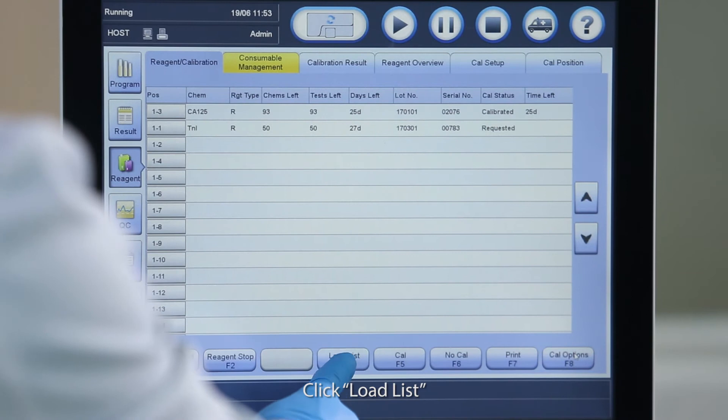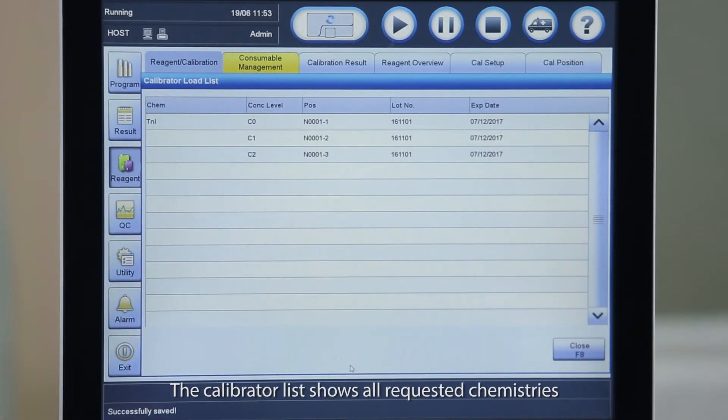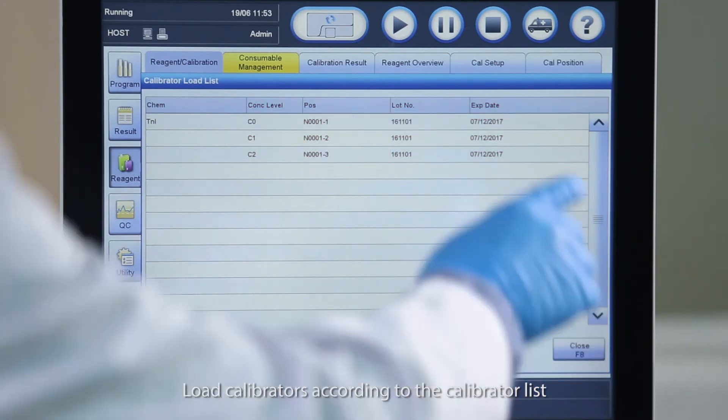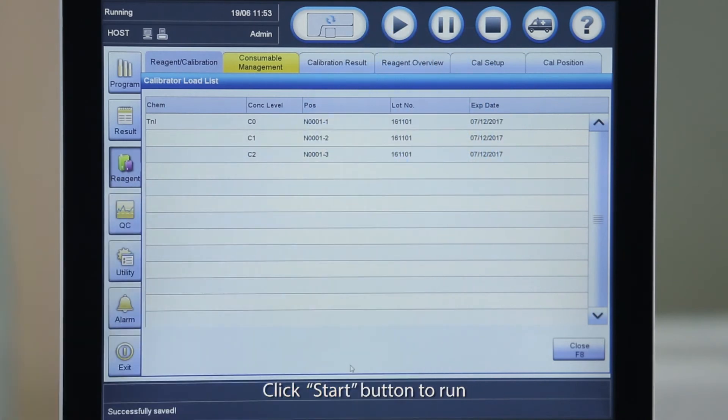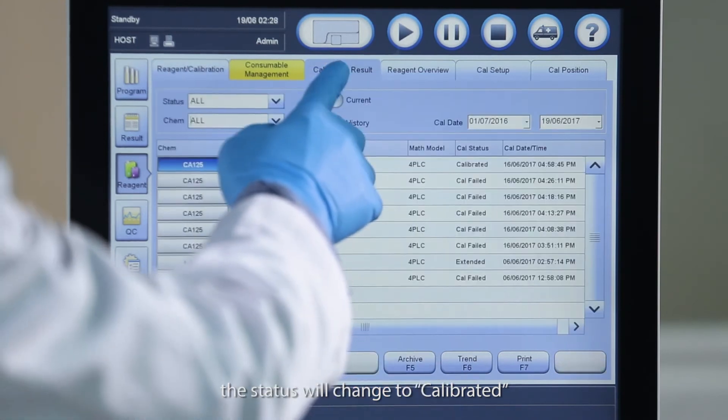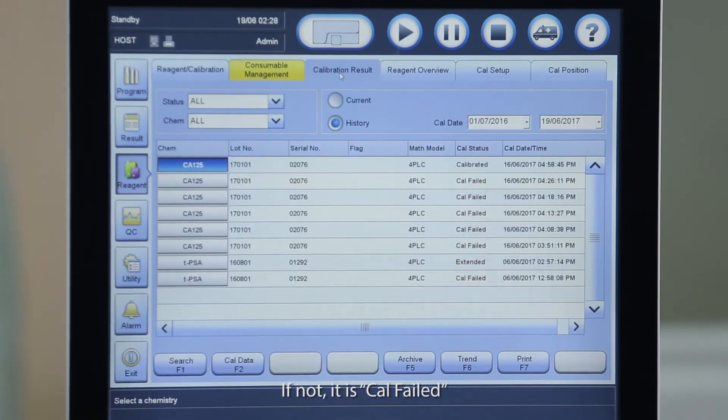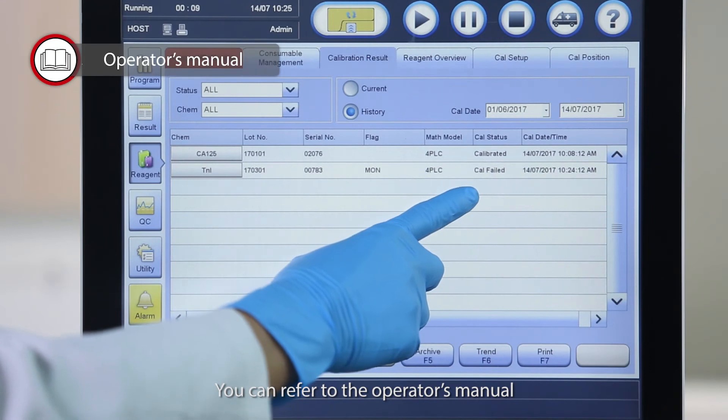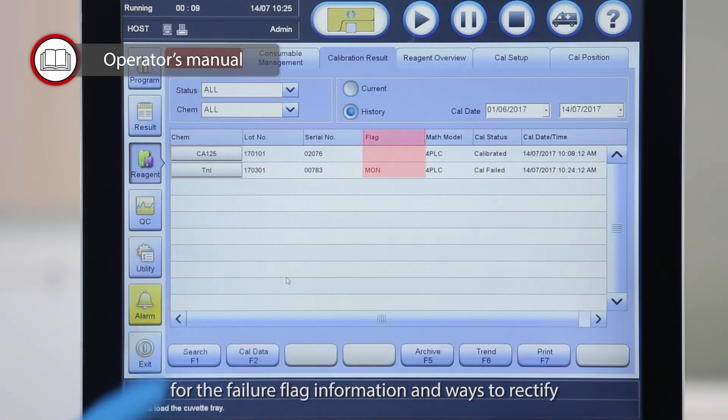Click Load List. The calibrator list shows all requested chemistries as well as calibrators information. Load calibrators according to the calibrator list. Click Start button to run. If the calibration is successful, the status will change to Calibrated. If not, it is Cal failed. You can refer to the operator's manual for the failure flag information and ways to rectify.